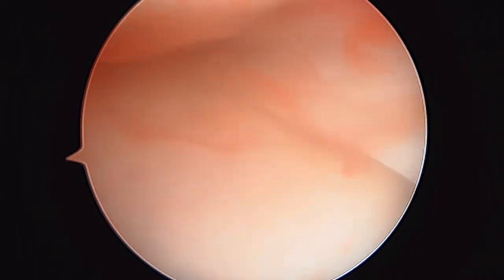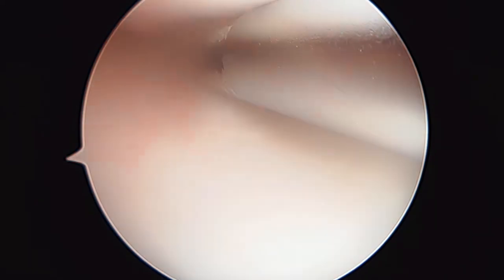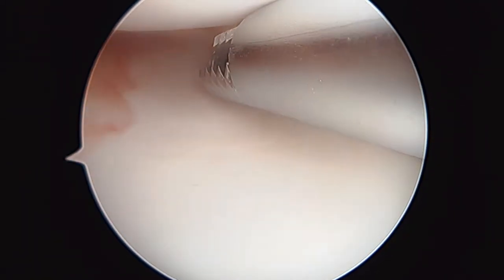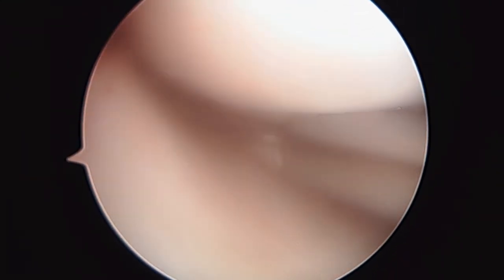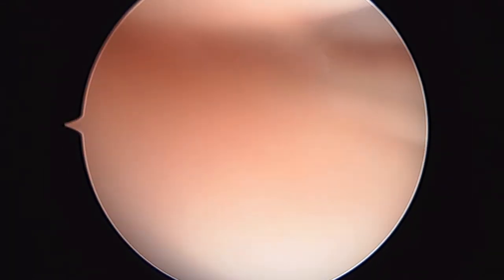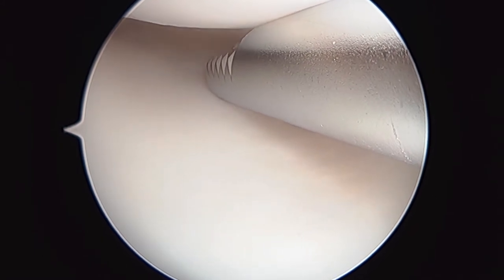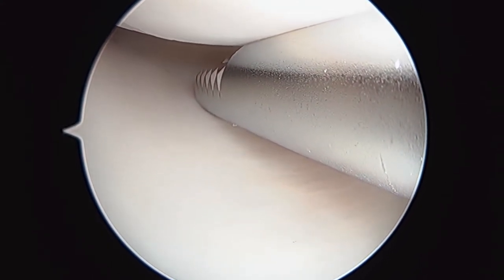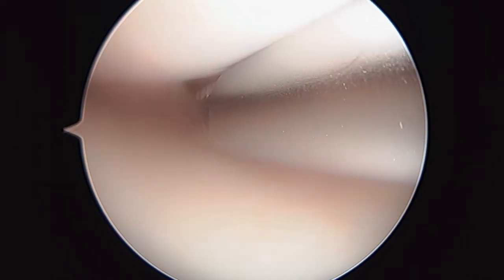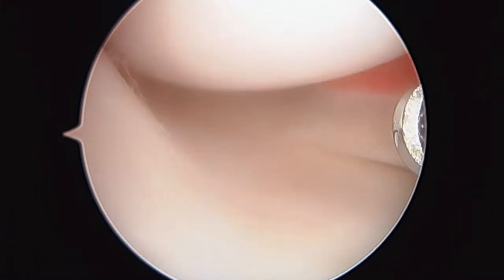We'll clear it out. I'm going to use a shaver for a minute because it has a little better suction on it. Here you can see the shaver coming in. This is the meniscus — this looks pretty good. We're going to get a good look all the way to the posterior horn. The patient is already below 100 on her systolic. The meniscus on the medial side looks pretty good, no signs of any significant tearing. Cartilage looks like it's in pretty good shape.